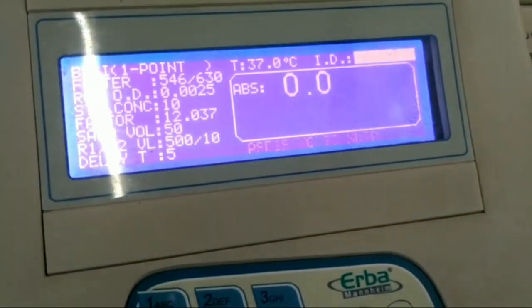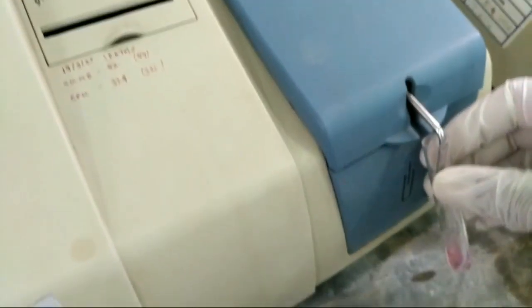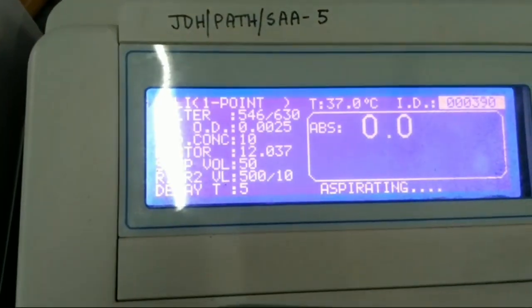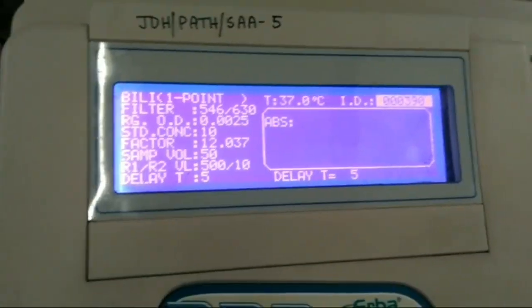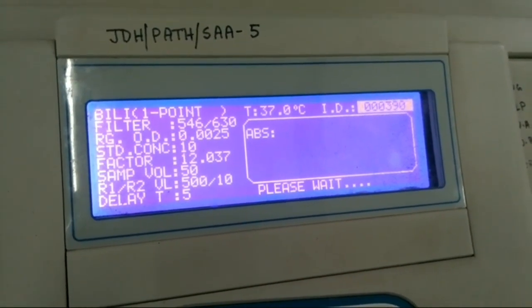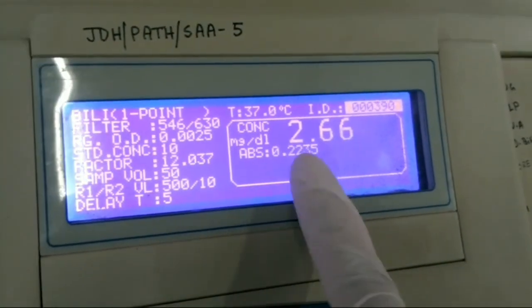Now we are going to measure. First, we have to omit the standard, then we are going to aspirate a sample. When we aspirate the sample, the machine will generate the report. This is the report of the bilirubin — the result is 2.6 mg/dL.